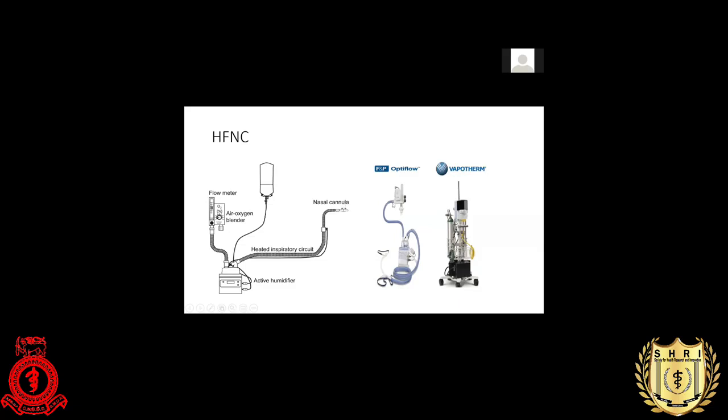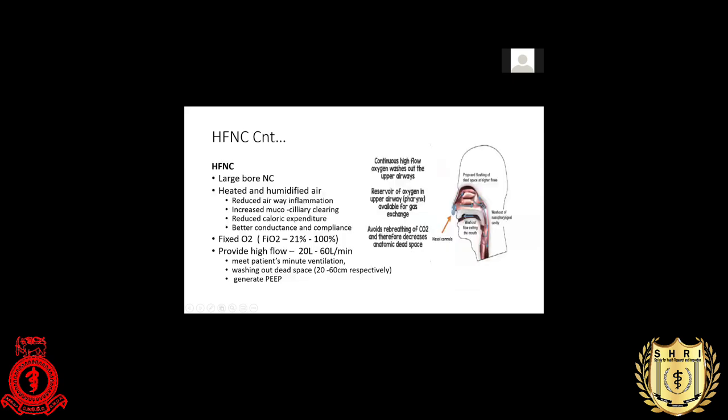This is a common machine available. This one is available in Sri Lanka. Okay, what is a high flow nasal cannula? It has a large bore when compared to the conventional nasal cannula. Because of that, you can give high flow to the patient, and it will supply heated and humidified air.